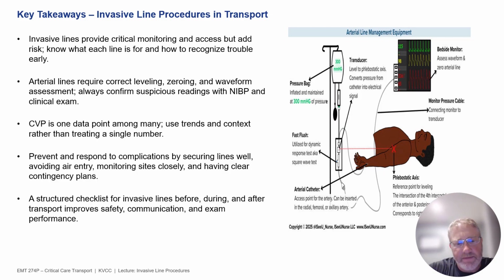And if you're able to have a systematic approach for those invasive lines, that can not only alleviate stress for you, but it can also help you to focus on other possibly more important things during transport, and not have to worry about the intimidating lines that are in.